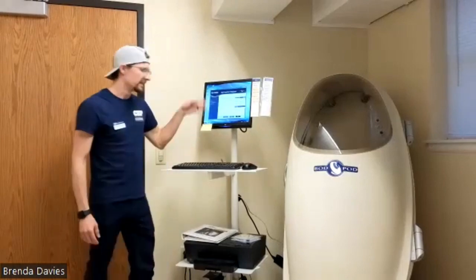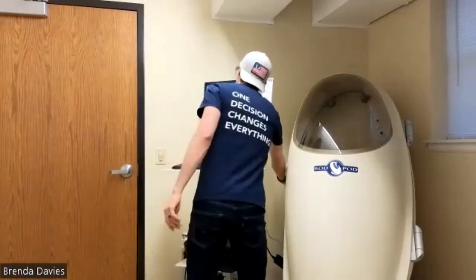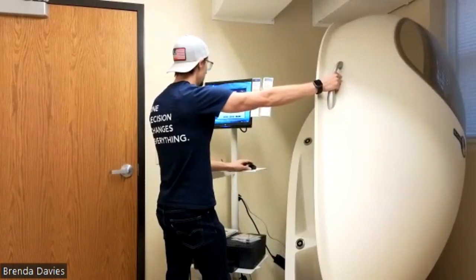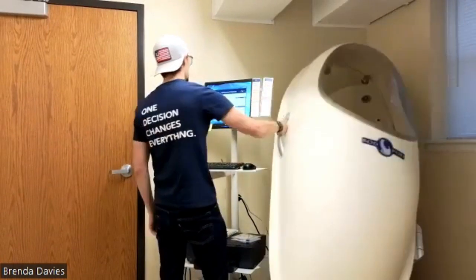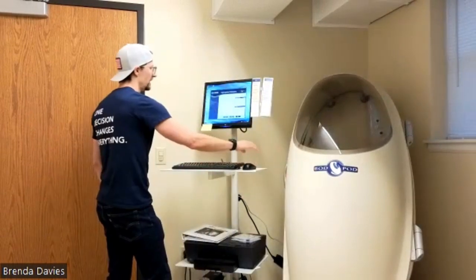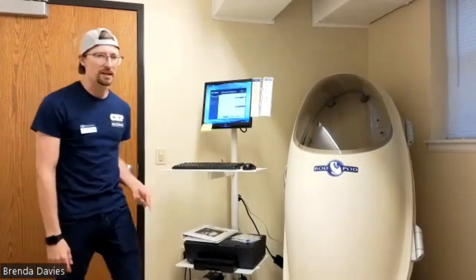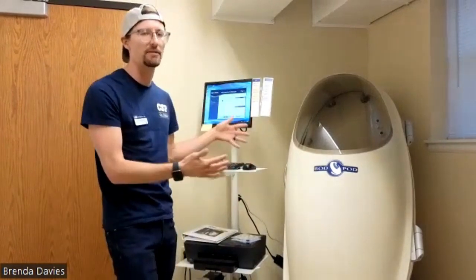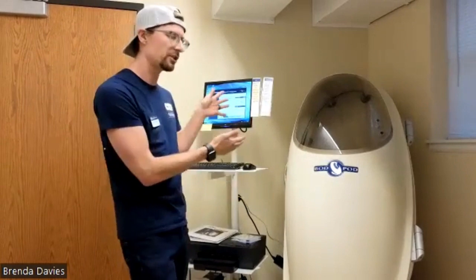All right, so like it says here, we're going to open the Bod Pod door, check to make sure that it is clear, and then we will close it. Again, just reading through the prompts and hit next. So what the Bod Pod's doing right now is assessing what a cleared Bod Pod volume looks like. So inside the chamber, what is this like with nothing in it?